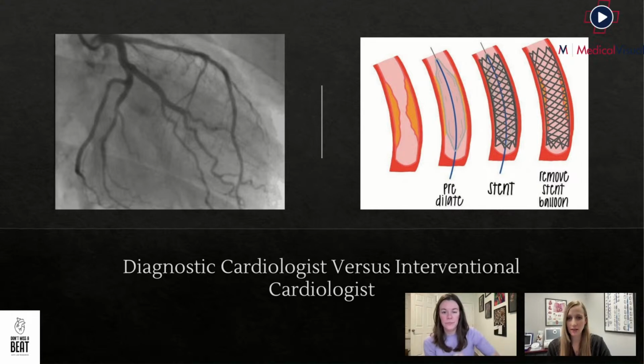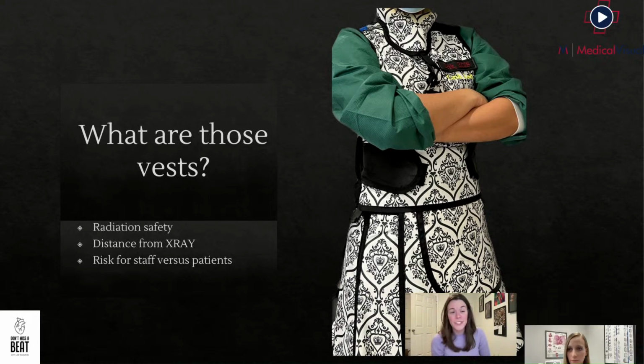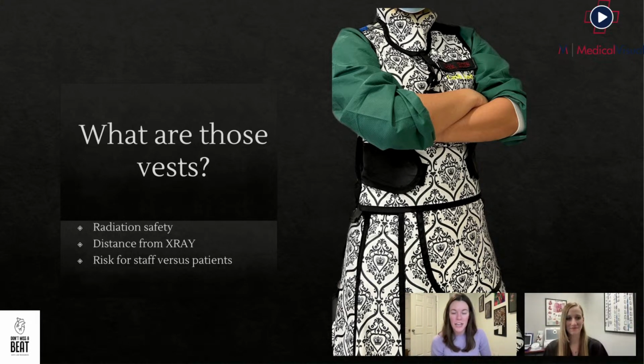Awesome. And then let's just talk about what the safety equipment looks like in the cath lab and why everybody is wearing these vests. Yeah, so if you look at the picture that we put before, the 3 people standing on the back wall, everyone in that room has these on, but when we're scrubbed in, we have these great big OR blue gowns over us, so you don't get to appreciate that and see it. A lot of them have these cool patterns on it, and the main reason is that if someone's wearing your lead, you know. But this one, for instance, this is a woman, and she has something around her neck, a top piece on the jacket underneath because it's cold in there, and a bottom piece that's like a skirt. So this is lead, and it really reduces your exposure to the radiation that we use.